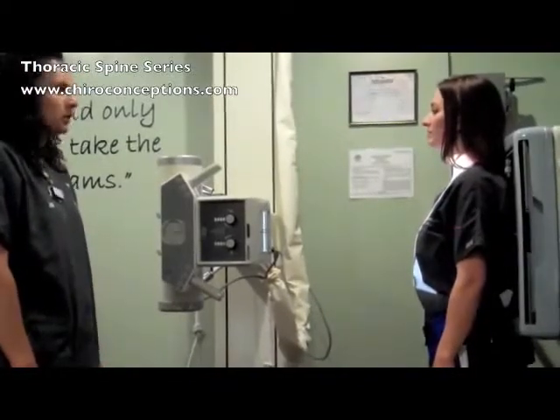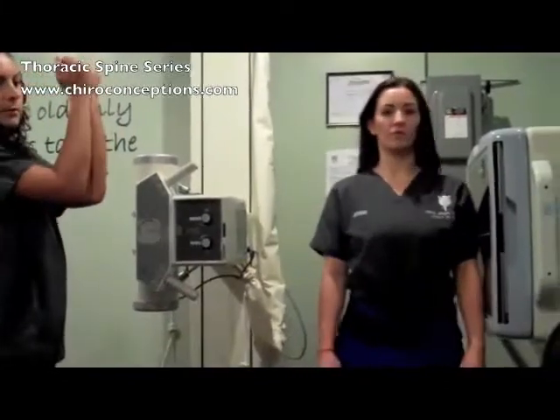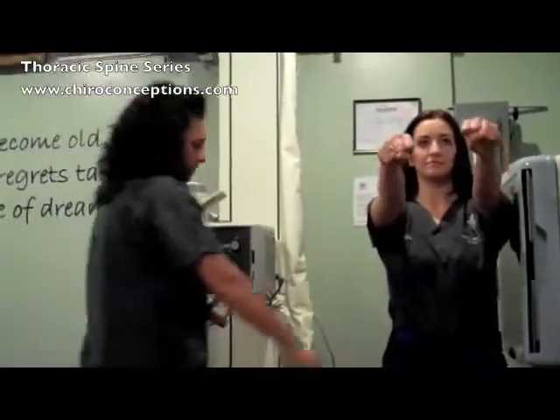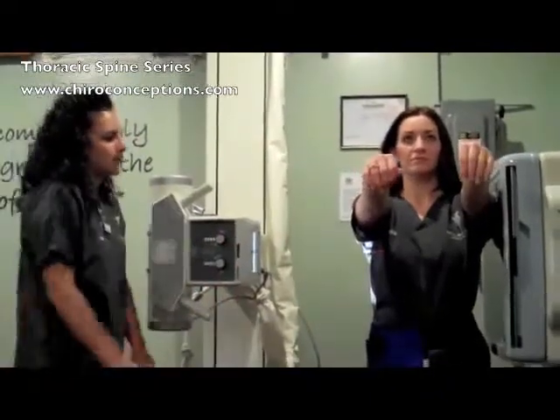Now the patient needs to do a lateral thoracic — have them turn to the left for you. Elevate the arms so you can get the ribs raised up away from the spine. You also want to turn their shield to block their right side from the radiation. Centering should still be at T7.